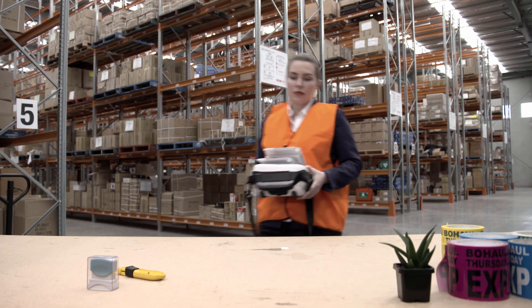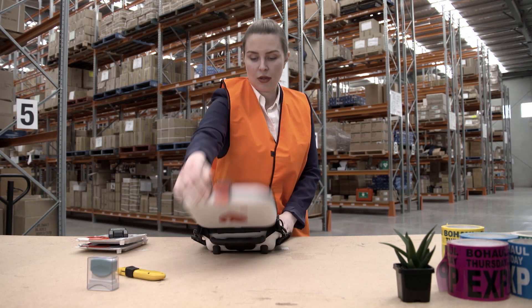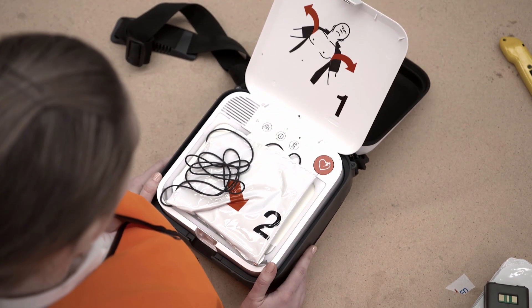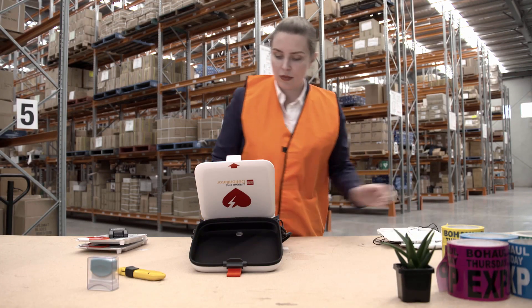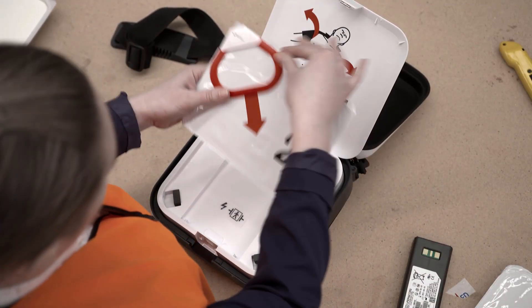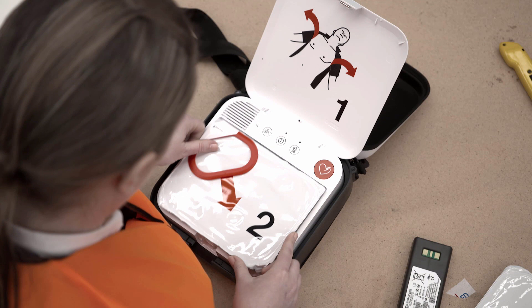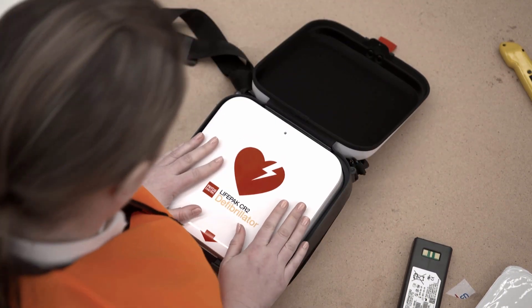Here we will show you how to change the batteries and pads of a LifePak CR2 defibrillator. To replace the pads, first open the lid of the defibrillator. Hold the off button down to turn off the device. Lift out the used or expired pads pack and dispose of it. Inspect the new pad pack seal and expiry date, then close the lid. The new pad pack is ready for use.